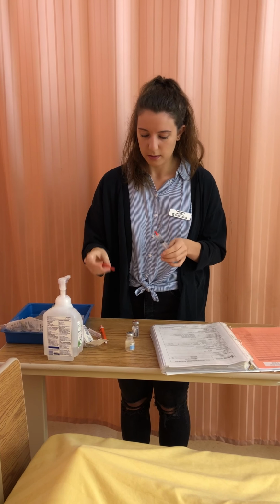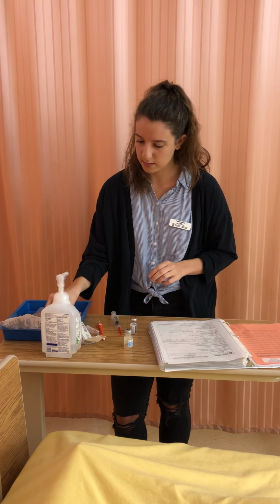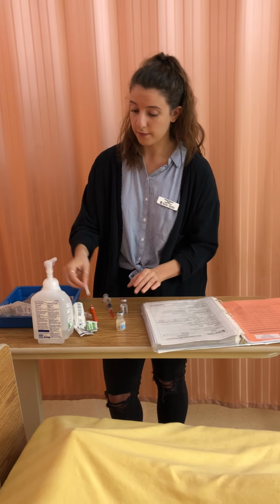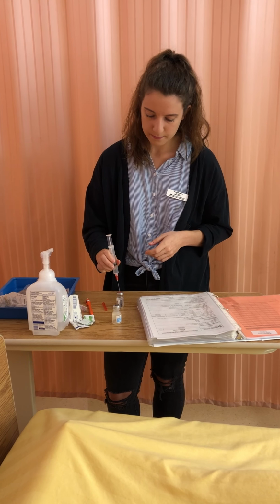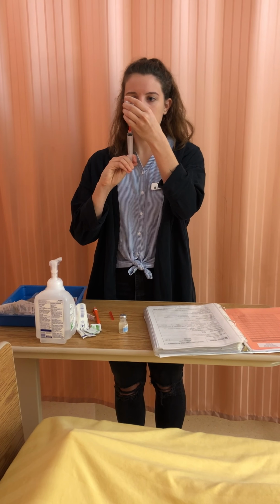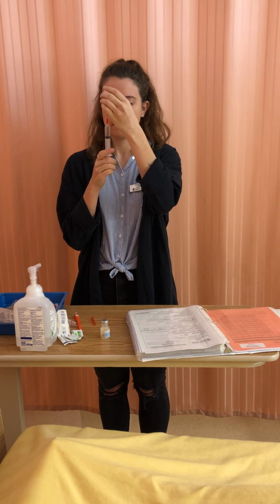So I'm going to swab it again, just in case. I'll just swab in for 30 seconds and let it dry for 15. Now I can put in my air. So I'm going to do my third medication check, and pull up that 4 mLs. So I'm comparing my syringe to my MAR.